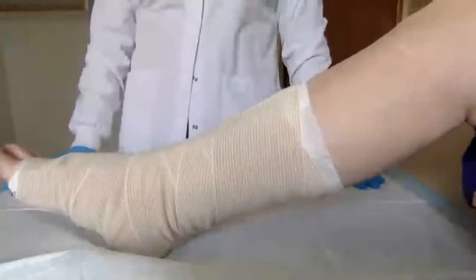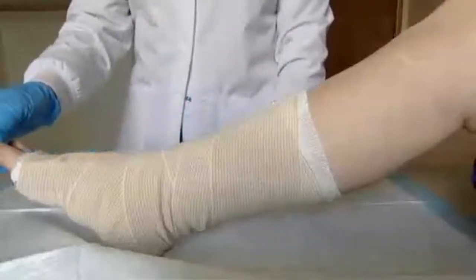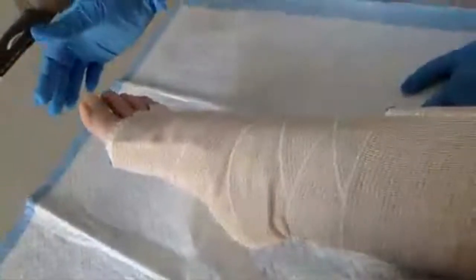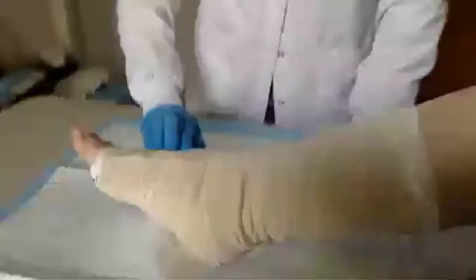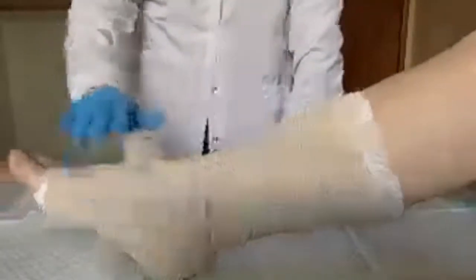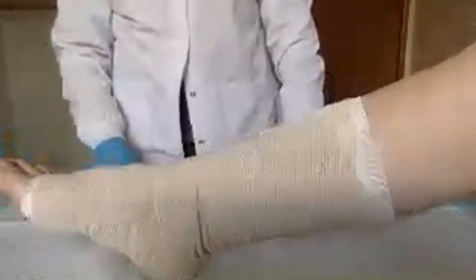All right. So it's nighttime now. You're putting your patient to bed and you need to take this off. I'll just reiterate again. Make certain after you have done your wrap, these will tighten up more. So you really want to check perfusion in the toes. You want to pinch the toe gently, but release and see if, checking capillary refill, does the toenail bed pink back up again? Yes, it does. You can also feel for a pulse. However, if the patient has a lot of edema, that's difficult to do. But definitely checking cap refill on the toes is very important.